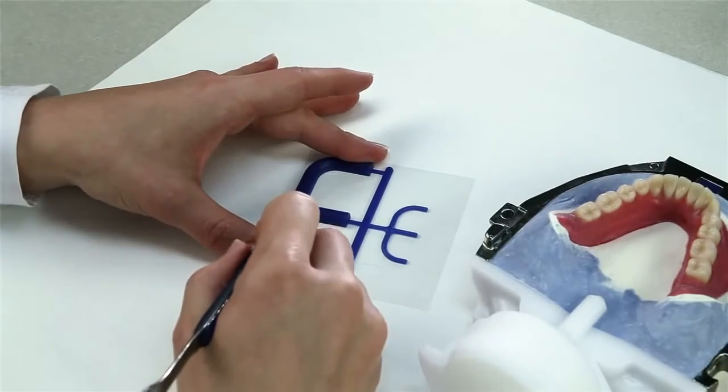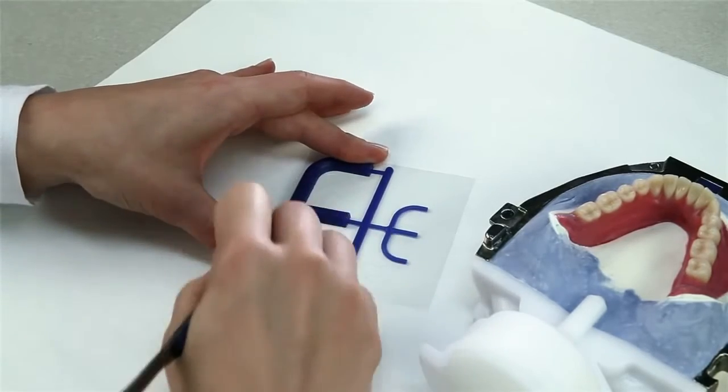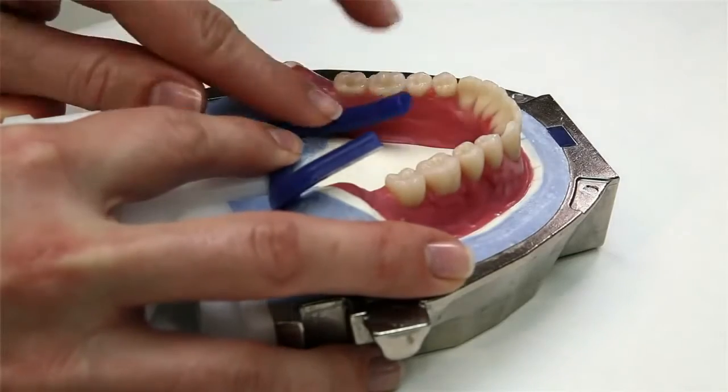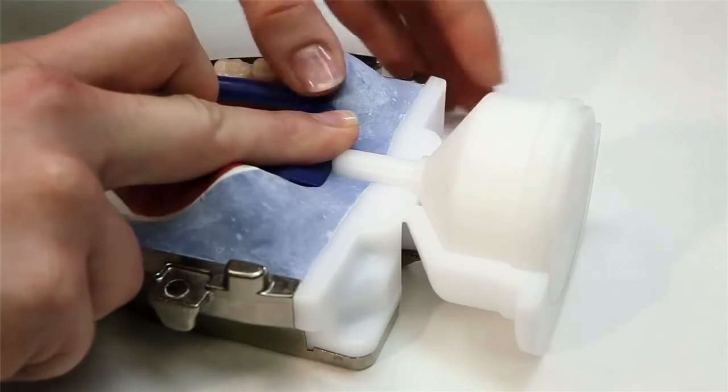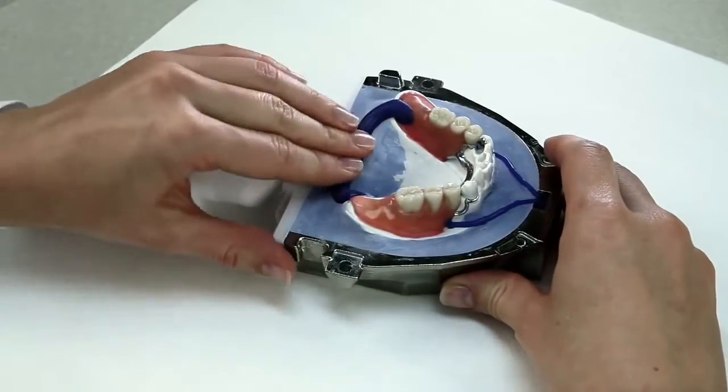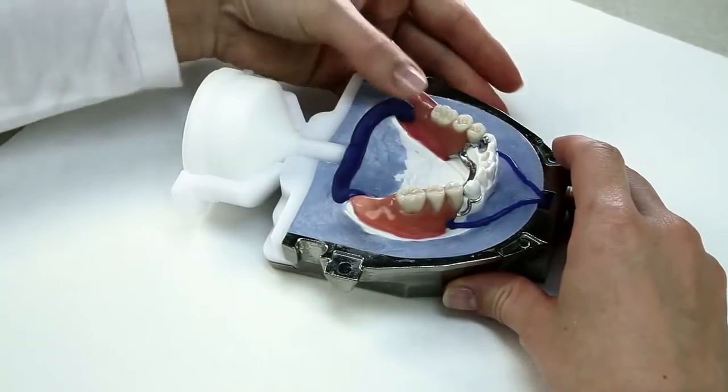For mandibular complete dentures, cut off the center sprue and place the outer sprues in the lingual area of the retromolar triangle. The denture saddles of partial dentures are provided with a sprue each at the dorsal ends.